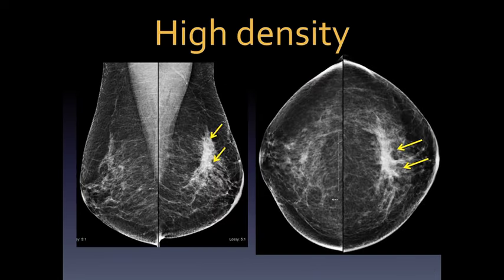Now we turn to the mammographic finding of asymmetry. By definition, an asymmetry is seen on two mammographic views but cannot be accurately identified as a true mass. Although it may represent normal breast tissue, further evaluation is often warranted to exclude a mass or architectural distortion. There are three types: a global asymmetry — large, greater than two centimeters in one breast; a focal asymmetry — small or less than or equal to two centimeters, always concerning when new; and a developing asymmetry, which has a high correlation with malignancy.